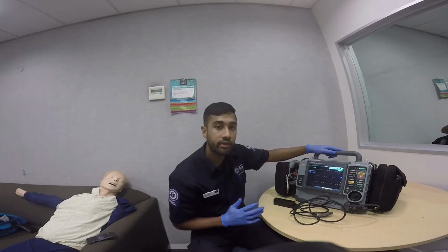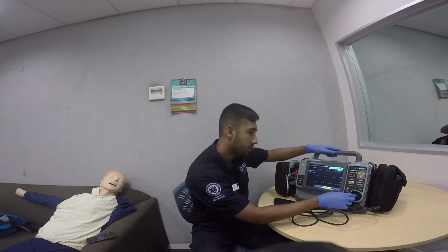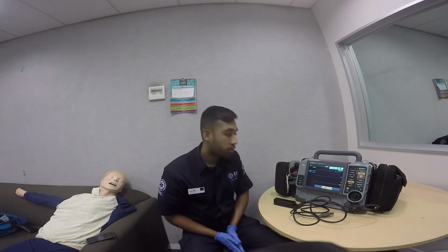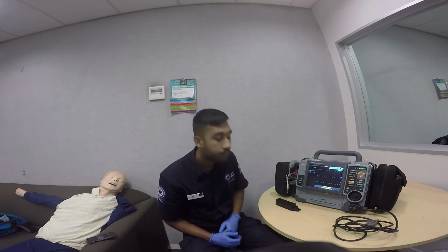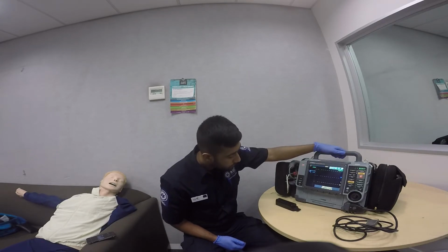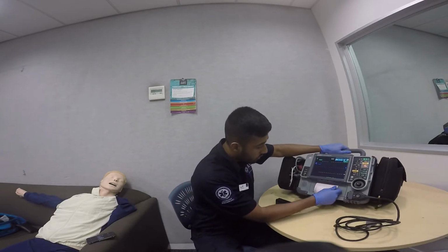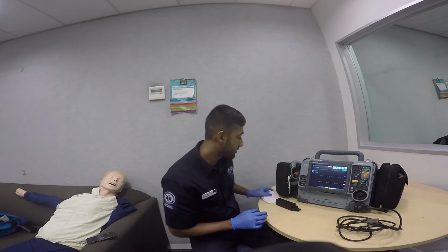Alright, after we've done that, we'll go to options, hit on user test, and once the user test is in progress, it should print out the test results below. So I'll just wait for that. Alright, so the test has indicated the user test is passed.